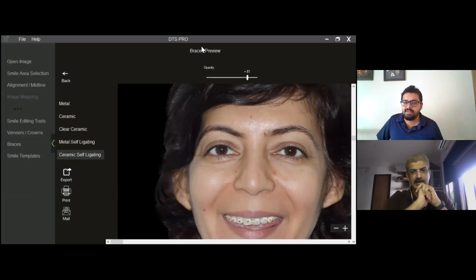So we are trying to incorporate all of this. I think when you come to 3D, you will be able to incorporate CBCT data also. Absolutely, DICOM is one part which can be supported. Perfect. But again, since we're talking of 3D, a little bit of extension on that.